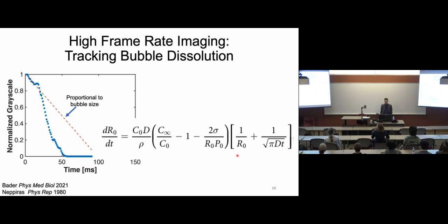And then again, how do you get to energy from there? Yeah, so you can back out, based off the scattering cross section, the intensity of the backscattered signal to roughly what the size is. You're trying to take the grayscale and, based off the scattering cross section, say okay, that's kind of the size. There is a lot of math associated with it, but that's it in a nutshell.